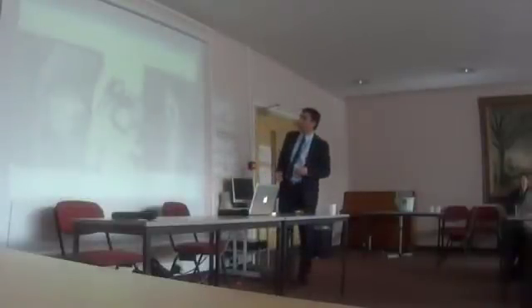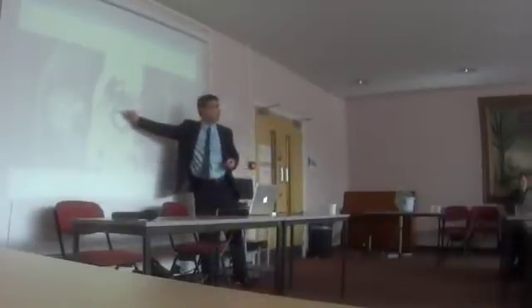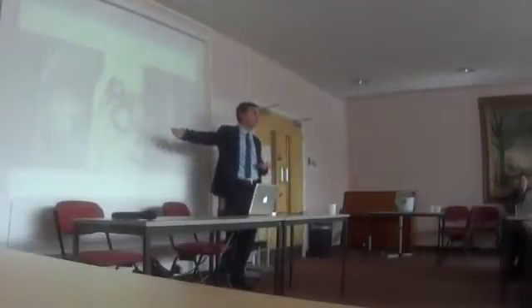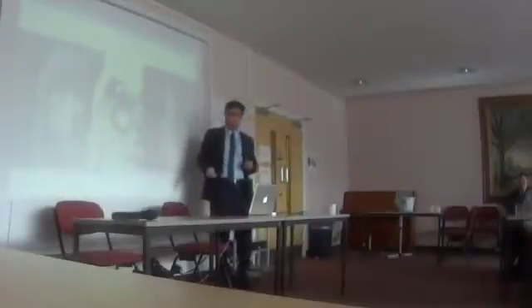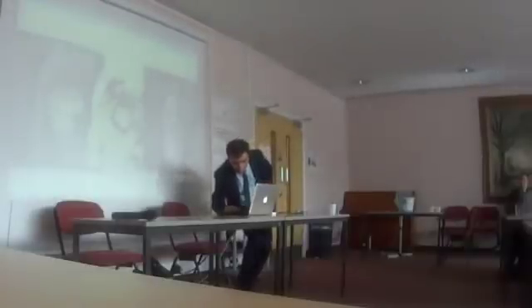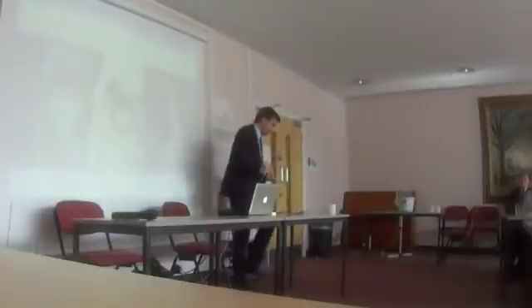And when we apply gadolinium, that's a scar, and you can see in the hypertrophic area of the muscle that is thick, we get the scar. This is sort of pathognomonic of hypertrophic cardiomyopathy. But at the same time, in fact, Richard suggested to me, before I get the headaches with this, why don't we do it for all the blood pressure?